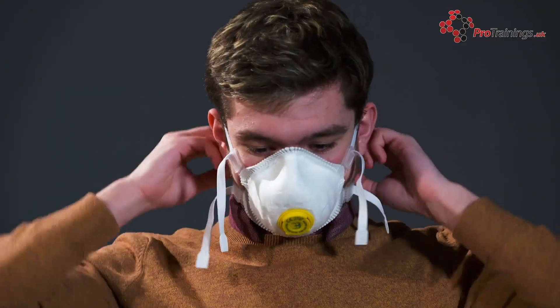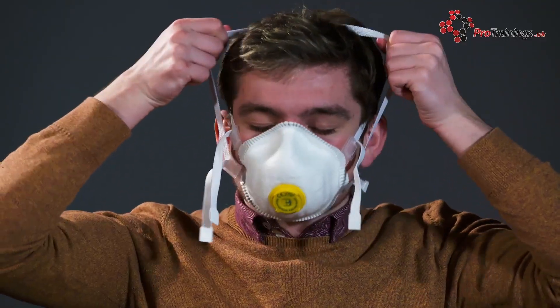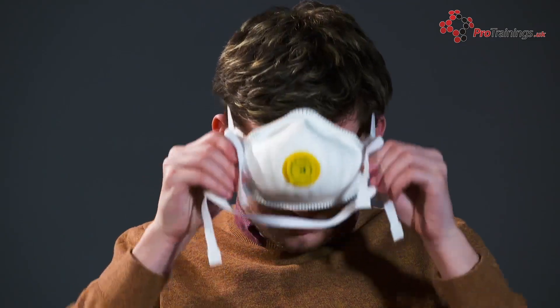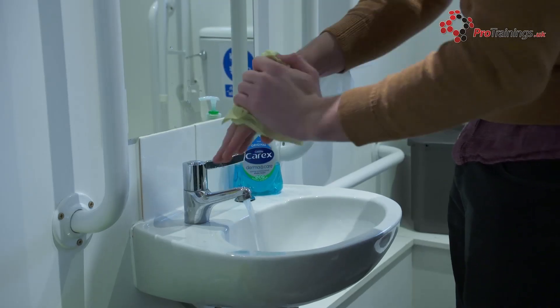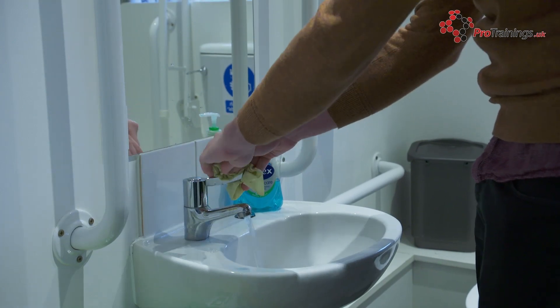After leaving the area, respirators can be removed and disposed of as clinical waste by untying or breaking the bottom ties first, followed by the top ties or elastic, and then removing them by handling on the ties only. Hand hygiene must then be performed after the mask has been disposed of.